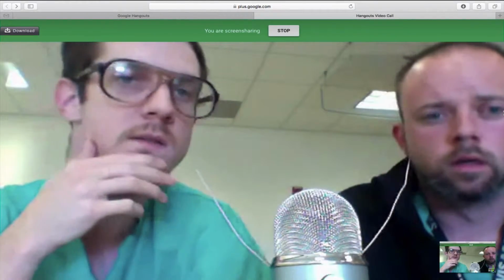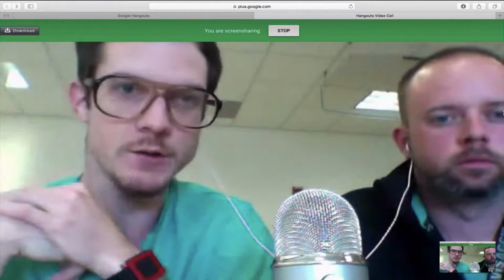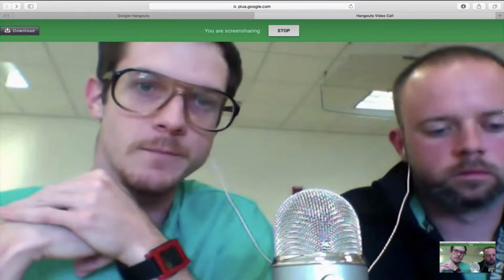Yeah, the EO fast, right? Yeah, there you go. If you've already got the ultrasound machine out, you're using it, all you really need is just some sterile ultrasound jelly and toss it over the eye to take a measurement. So all I can see it doing is improving patient care. The question is, is it going to improve the care for enough people that it's going to make it cost effective and energy and time effective as well?